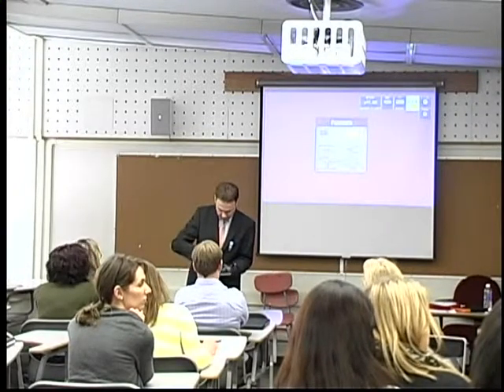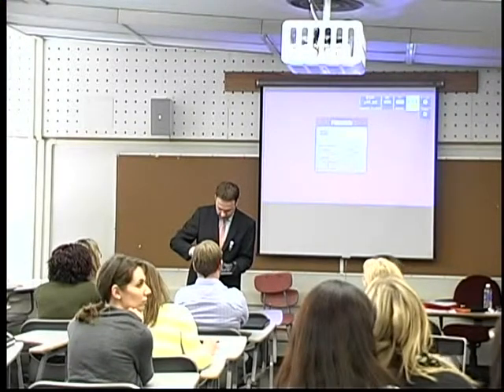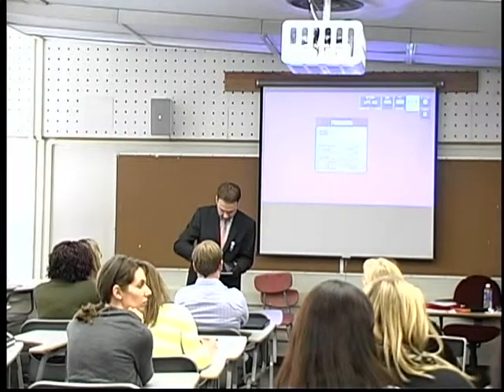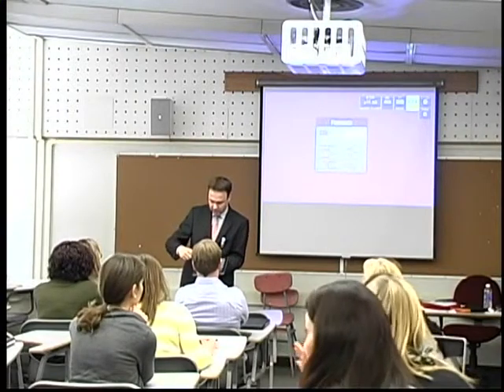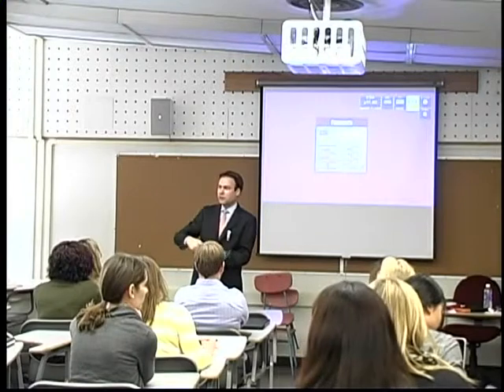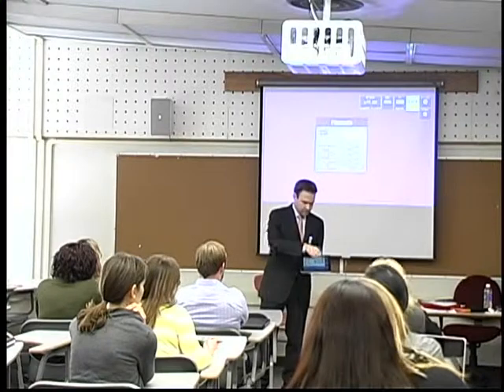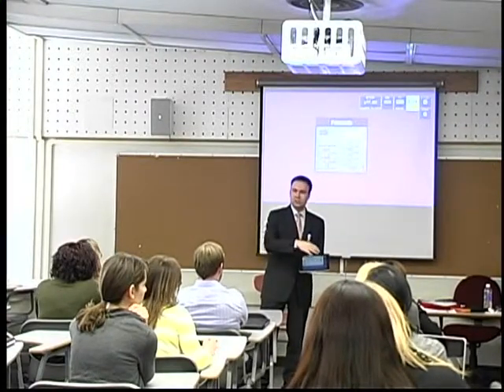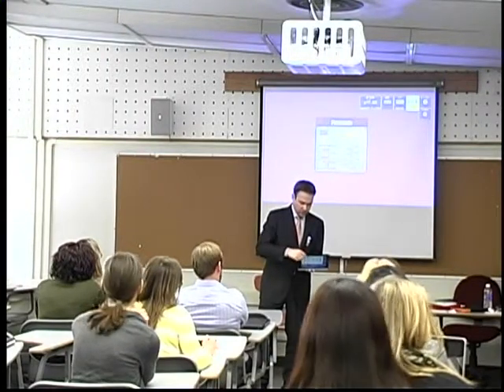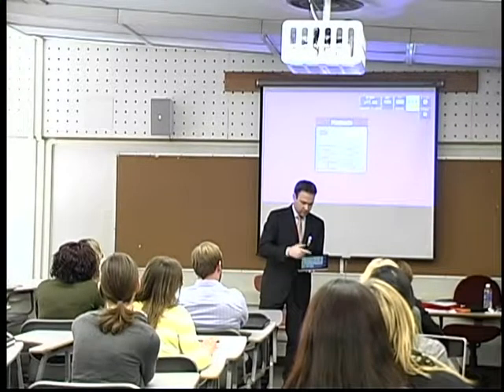Then I go back into play mode, and then all that's on there is just one sheet, very simple, and it doesn't have this area on the top. If this is too much to handle for a beginning communicator, then you do just one activity sheet and go. Yes, no, many.